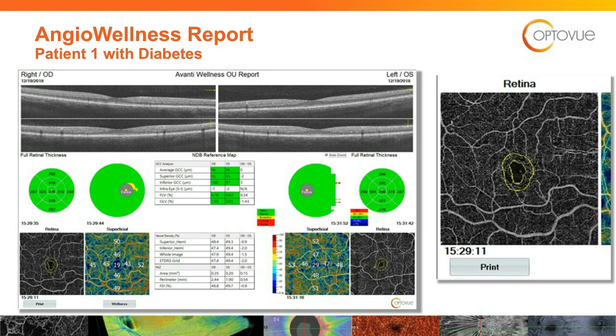And then if you look between the 2 yellow lines, I guess on the temporal side, you'll see a little dropout. And so this is a patient that comes in, and we would dilate them, see no dot hemorrhages, blot hemorrhages, exudates, so on and so forth, and we'd think that they were perfectly fine, and we're picking up diabetes and vascular changes at the highest level here that we can pick them up, and coaching the patient.